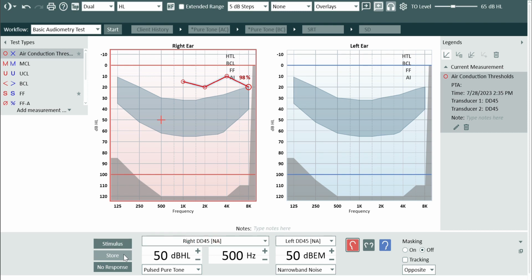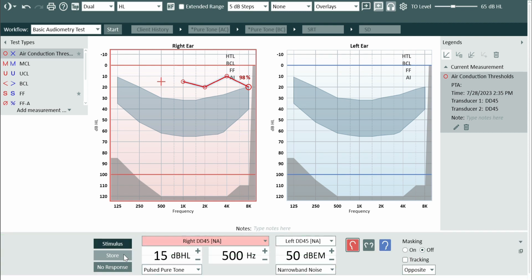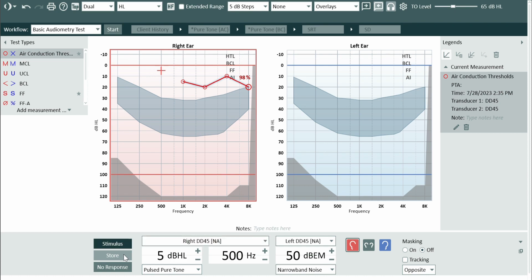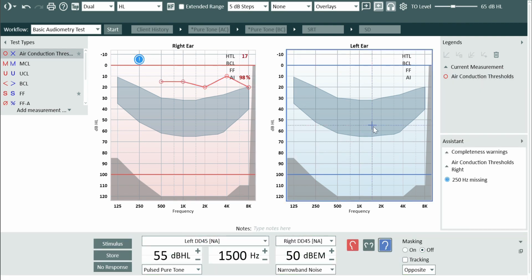process. By adhering to these predefined steps, the risk of oversight, errors, or omissions is significantly reduced, resulting in more reliable and trustworthy assessments. One of the most significant advantages of the completeness criteria is its ability to nudge service providers to fulfill all mandatory steps. In situations where a provider inadvertently overlooks or omits a crucial aspect of the assessment, the system proactively reminds and prompts them to revisit and complete those steps.